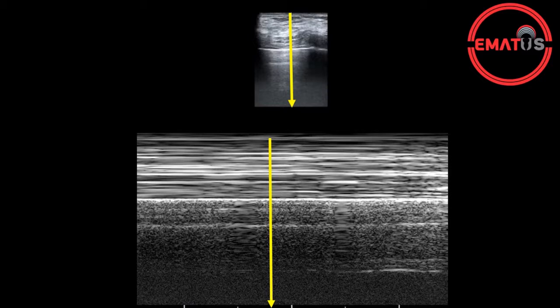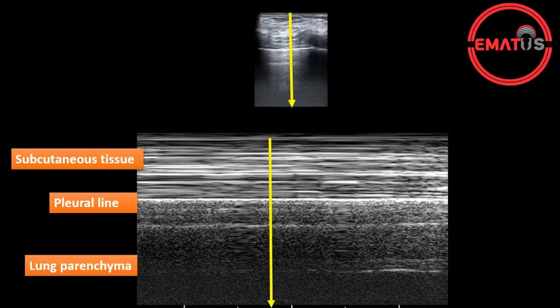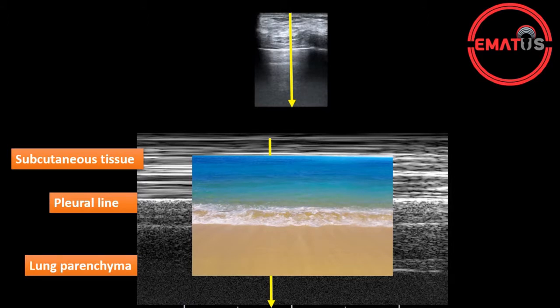After completing the evaluation in B mode, proceed to M mode evaluation. The M mode cursor placed vertically on the space between two ribs will provide visualization of the skin, subcutaneous tissue, pleura, and lung tissue respectively. In the normal lung, the skin and subcutaneous tissues appear as linear strands, while the lung tissue under the pleural line will create a granular image. This finding is also referred to as the seashore sign.